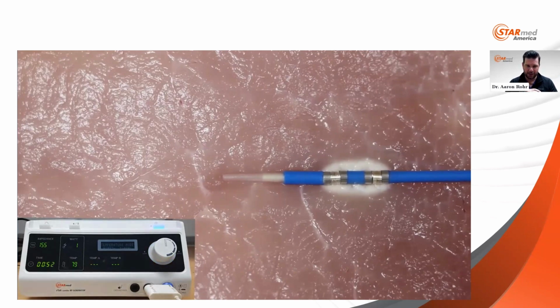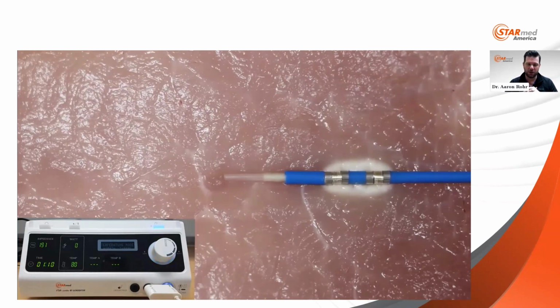I will say this is a little sidebar for something I'm sure we'll be discussing later as far as how we do things. I was initially using anesthesia on these inherently, just in order to make sure that they were tolerated well. And then I have now moved away from that, for the large part, to go with moderate sedation. At our institution, moderate sedation typically includes fentanyl and Versed at varying doses to keep the patient as comfortable as possible. I will use lidocaine at the entry site.